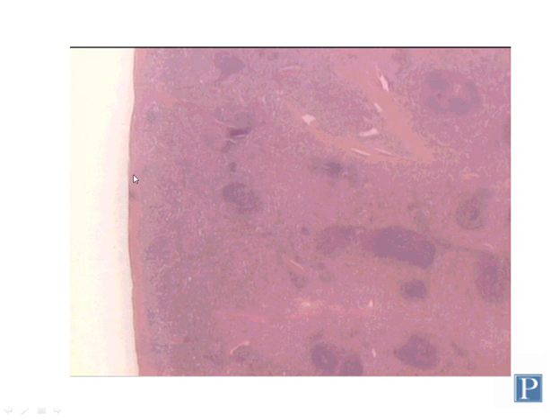So spleen, like lymph nodes, is encapsulated, meaning it has a connective tissue capsule, a fairly thick capsule that you can see here, which again is eosinophilic due to the presence of a dense irregular connective tissue. Also, like lymph nodes, the connective tissue capsule extends inward into the outer portions of the spleen, forming structures again known as trabeculae, which you can see here.